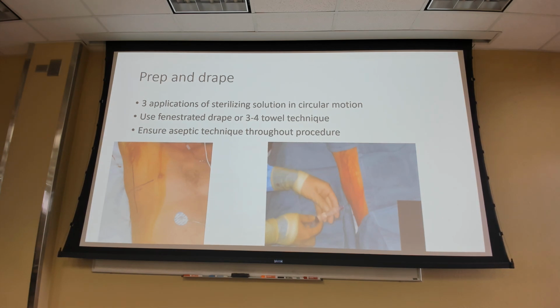And then obviously we want to identify our location. Like they have an X on there, which is, they're doing this for training. I've never seen anybody draw an X on there, but hey, if you've got the time, you should identify the right location prior to any procedure.